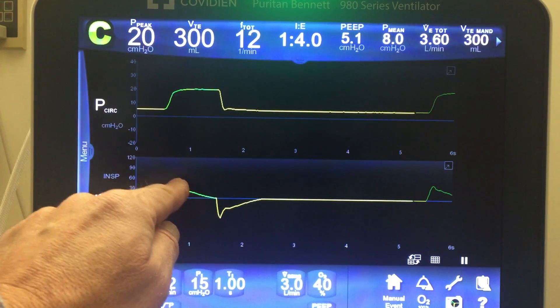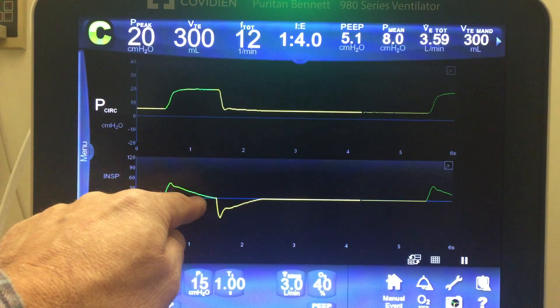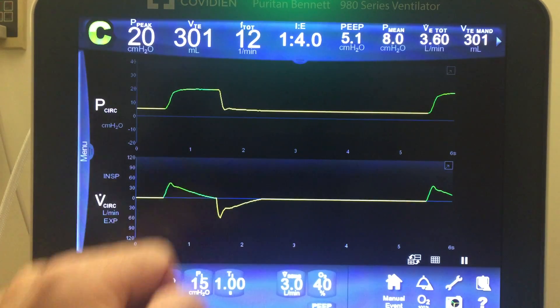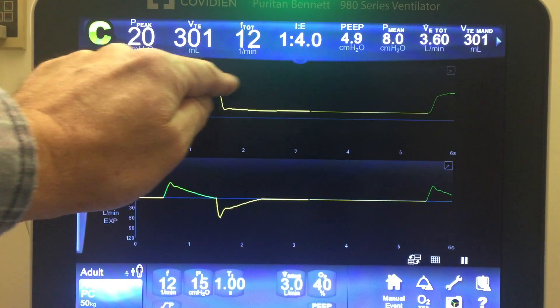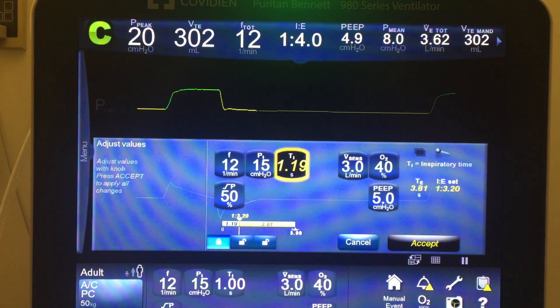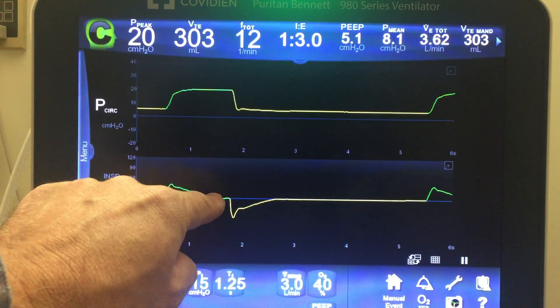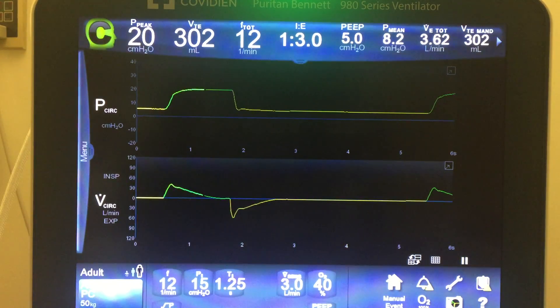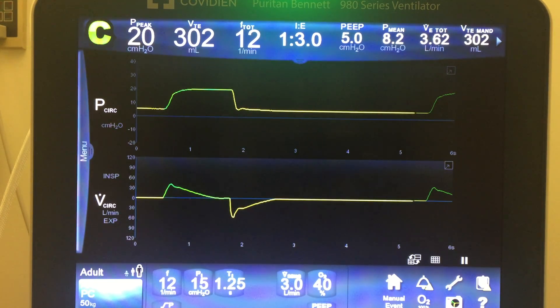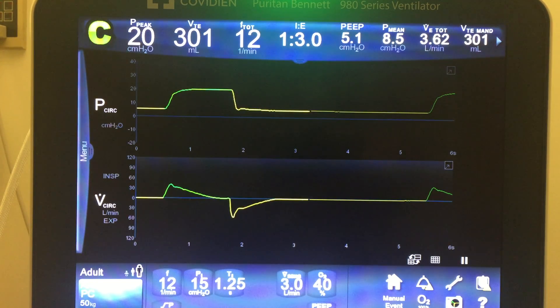Flow goes in, pressure is met, flow goes to zero. If this lung had a lot of resistance, or we had some small airways with natural resistance, the flow would hit zero sooner. But flow goes in, pressure is met, flow drops to zero — but the patient can't exhale until the I-time is over. So in pressure control, I-time doesn't control flow, but it does control the hold. If I lengthen I-time, you can see it's a lot longer, and actually the flow did go to zero — this short little time here is a pressure hold. So I-time becomes an oxygenation and alveolar recruitment strategy; it essentially holds the pressure in there longer to pressurize the lungs and oxygenate. Now we have an extra tool in our oxygenation tool belt: FiO2, PEEP, and in pressure control, we also have I-time.